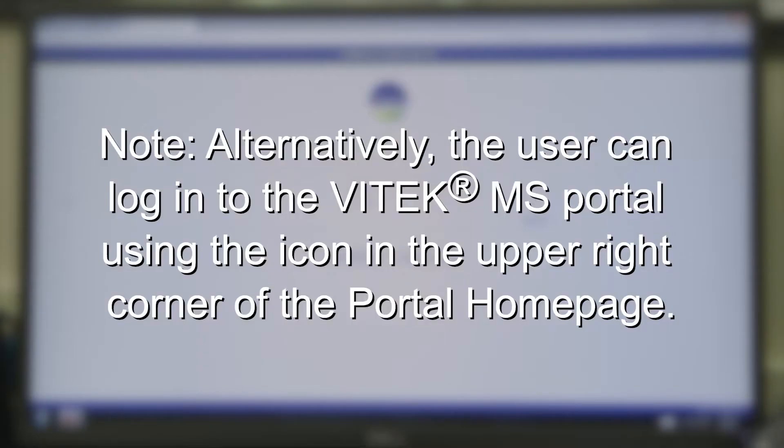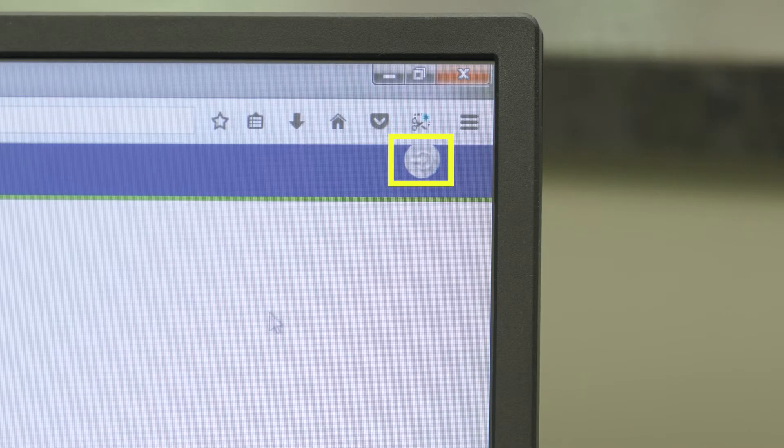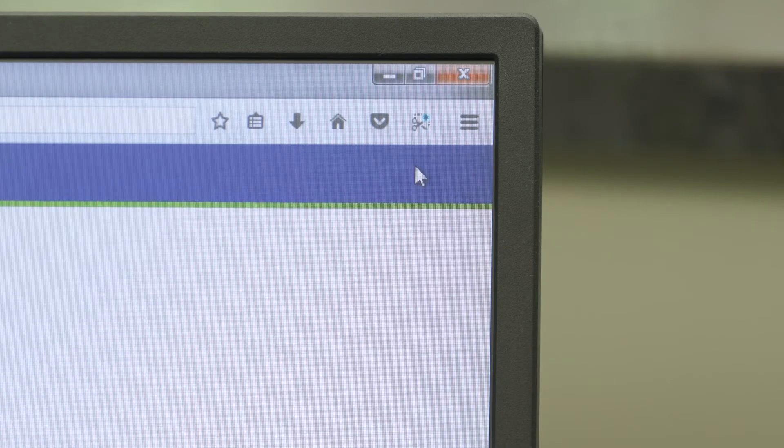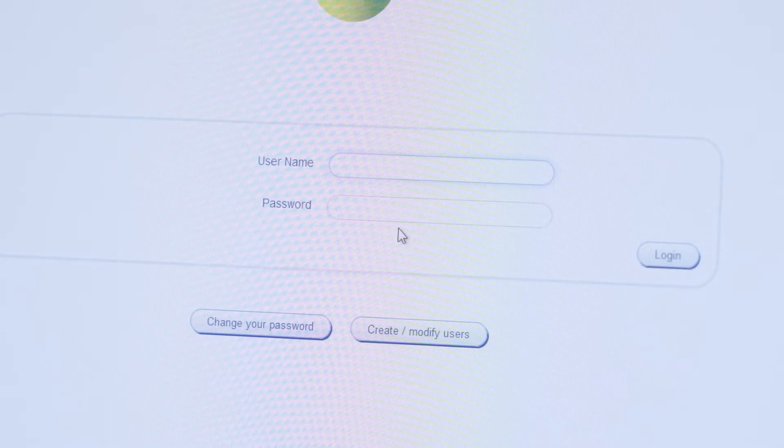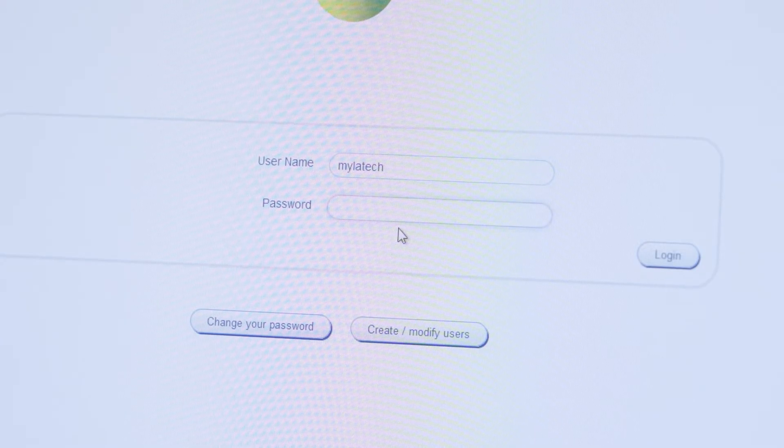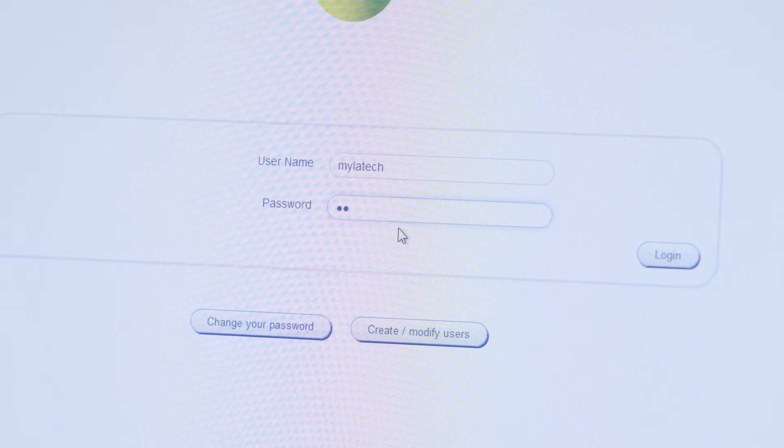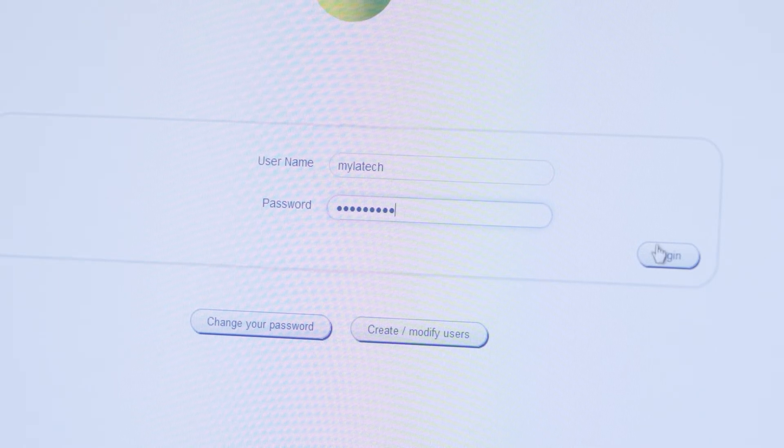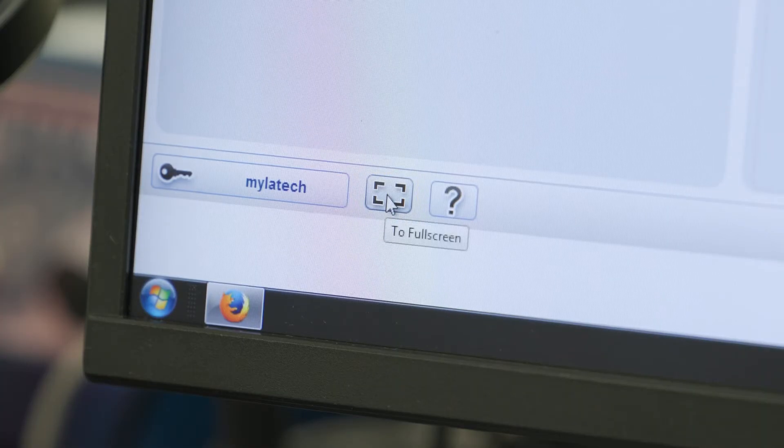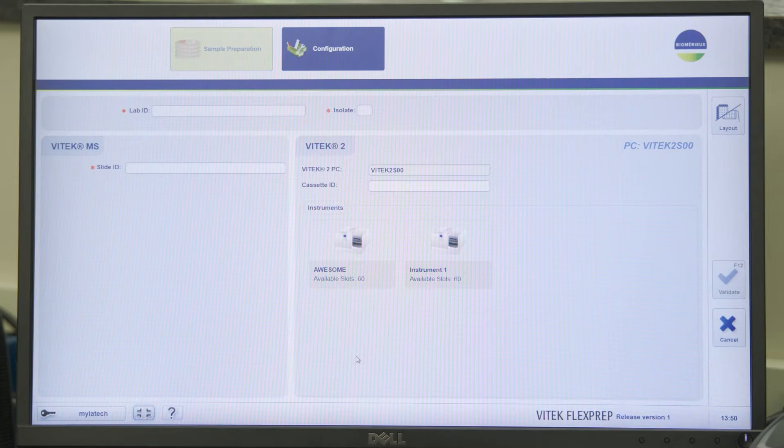Alternatively, the user can log in to the Vitec MS portal using the icon in the upper right corner of the portal home page. Log in using a username belonging to the Vitec MS Prime or Vitec MS user groups if applicable. Click on the full screen icon to optimize view of the screen.